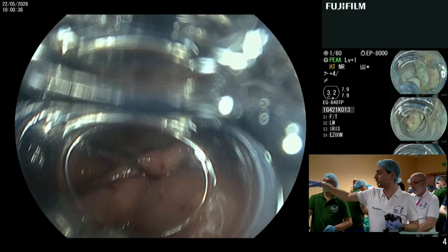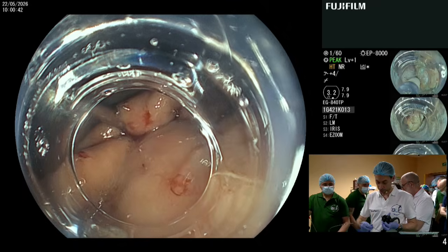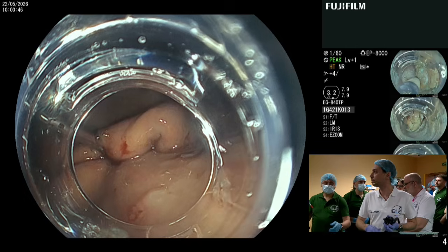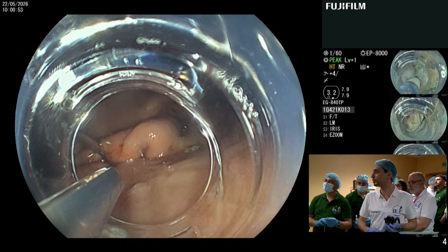But I can use large standard clips. So give me the 17 clips. I will place them around this mantis clip to secure the closure. The mucosa is thick, so it's better to use mantis clip for this step.